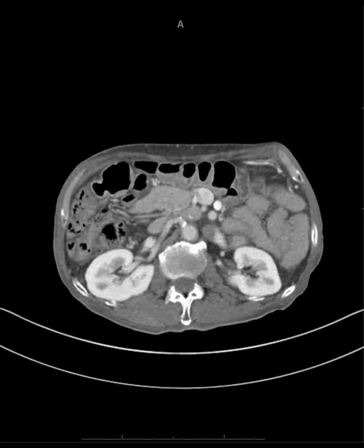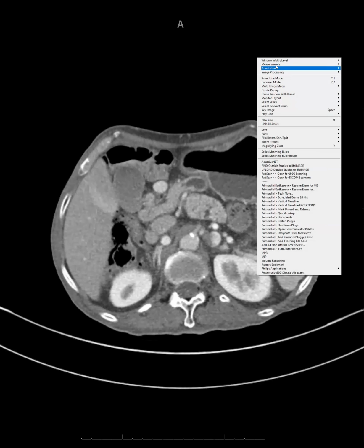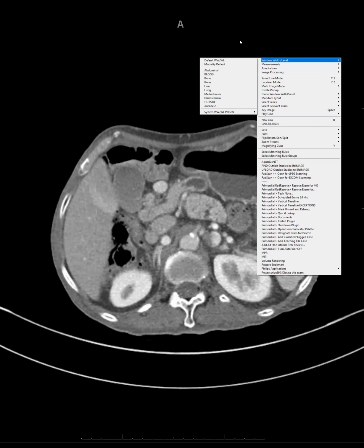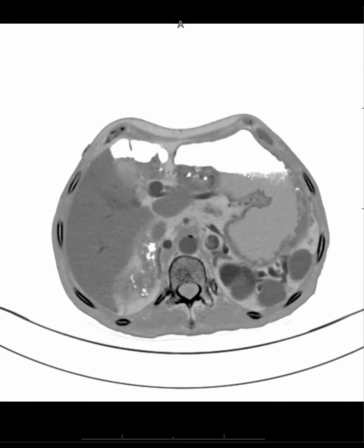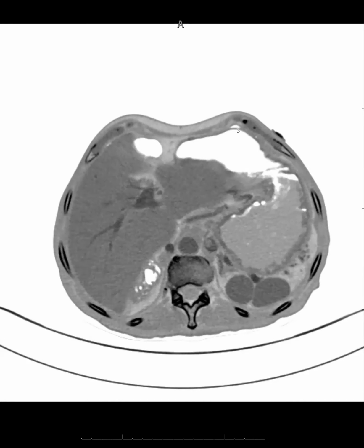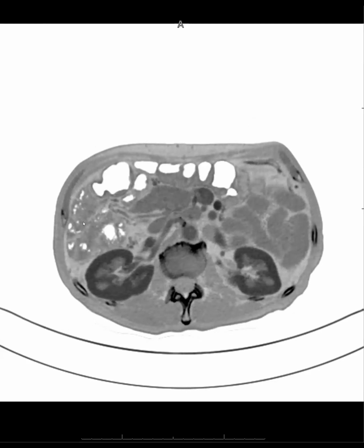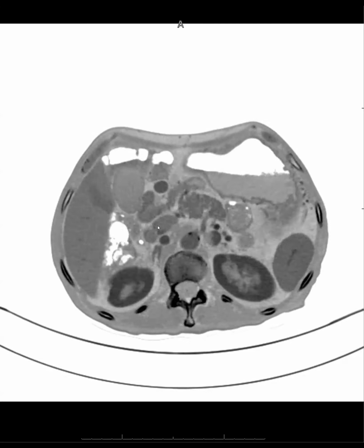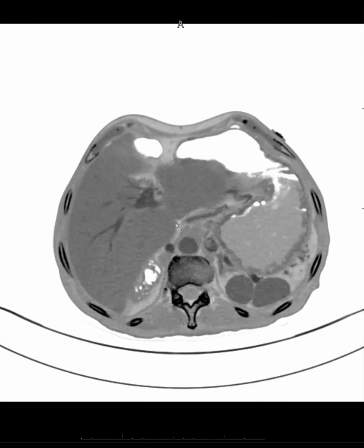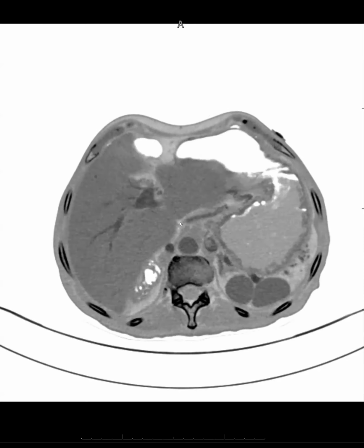Show the lung window. And some free air. And here, I like to do this. I know it's really bright, you guys, I'm sorry. I love to do this, to look for air. Invert it. So there's a little bit of free air and some bubbly lucencies in the wall of the bowel, we think, and also some air in the vasculature. It's really kind of subtle.